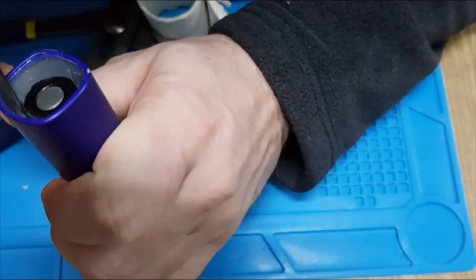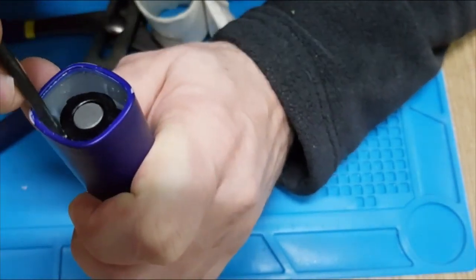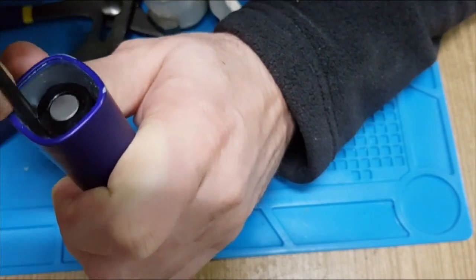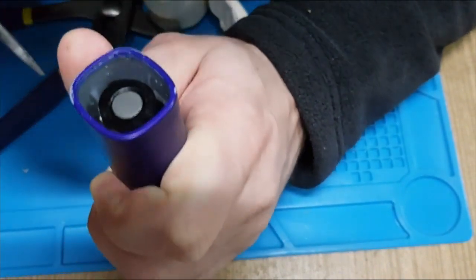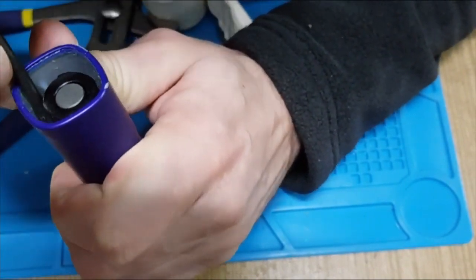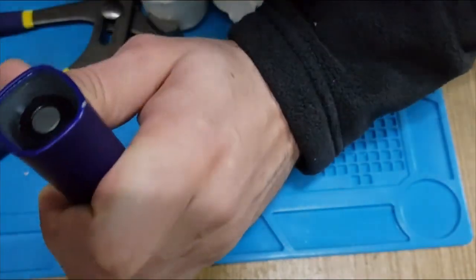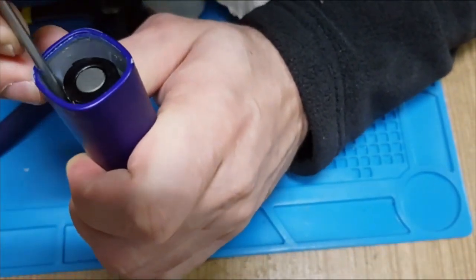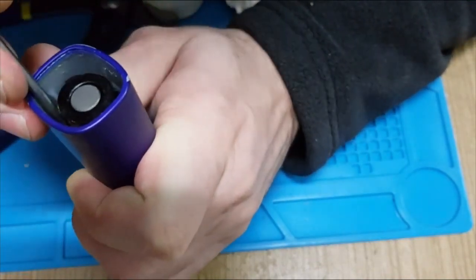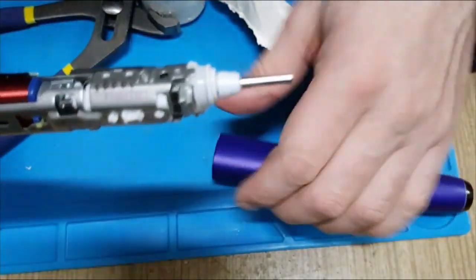It's usually better to see what you are doing, but for the purpose of demonstration, up. Out. Let's take another tool. Up, and it's out.